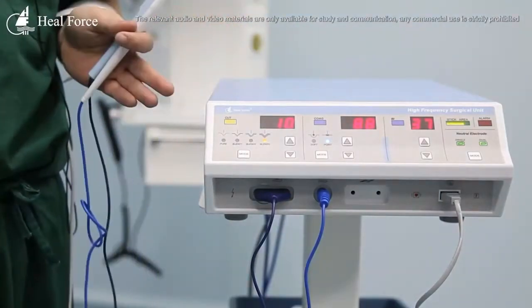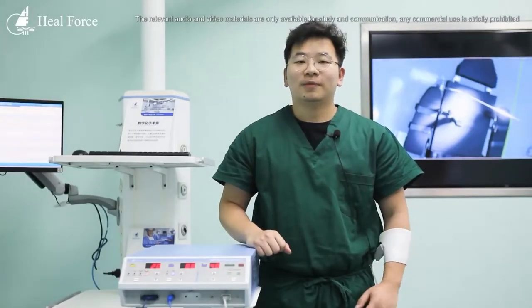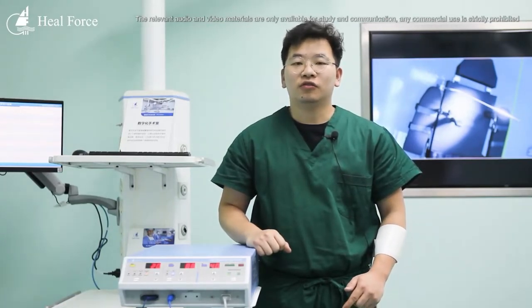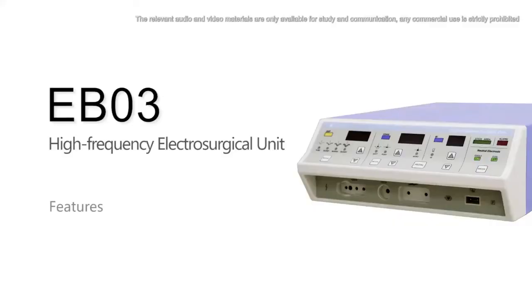That's all for the EB03. That's basically everything about this equipment. We are going to look at the following video to learn more.